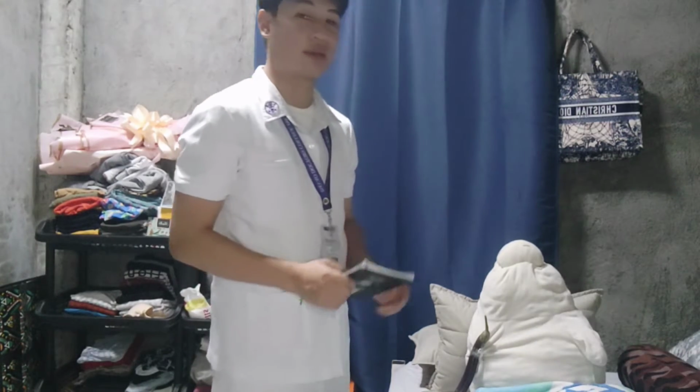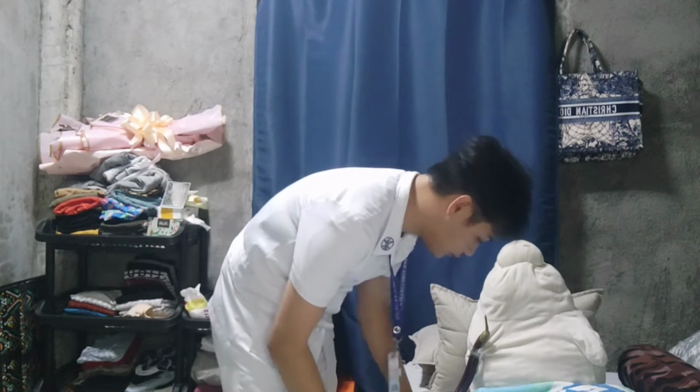So next is we need to organize the equipment. This is to promote efficiency and to eliminate delay to the procedure. So we need to prepare again the medication that we are going to administer to the patient now. We've already withdrawn the medication, so we need to prepare it now.